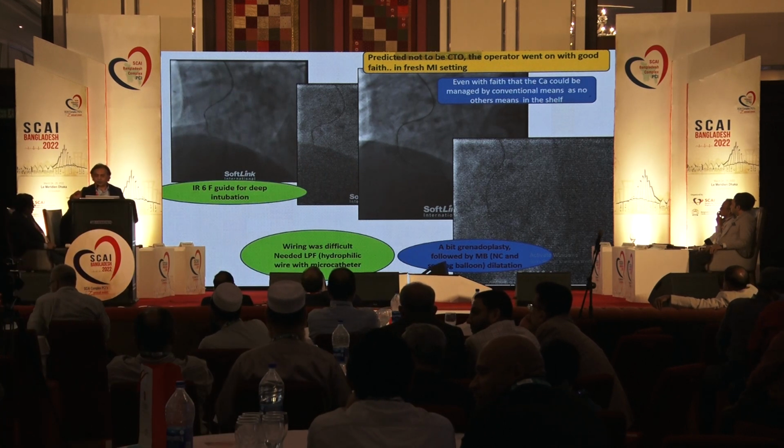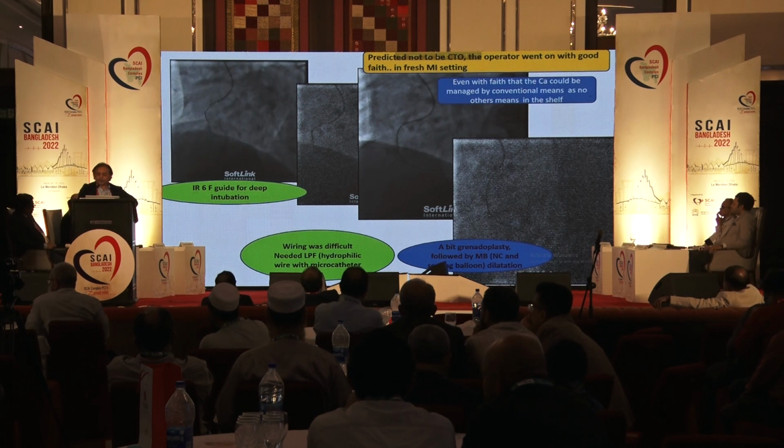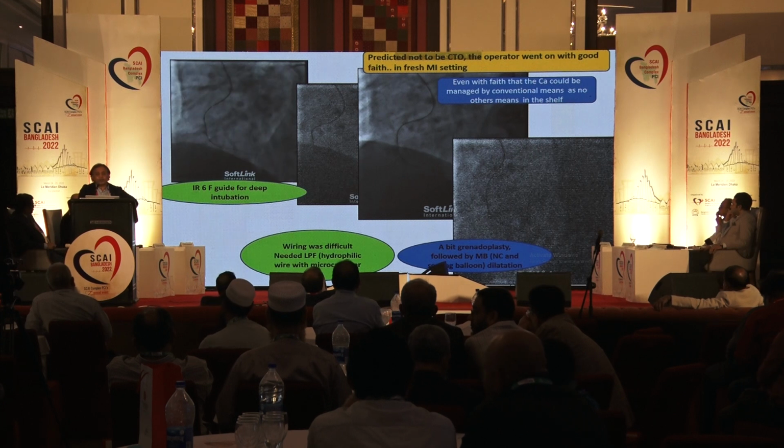The operator, because it was not the same operator, went on with good faith in a fresh MI setting, even with the faith that the calcium could be managed by conventional means, as no other means was on the shelf.